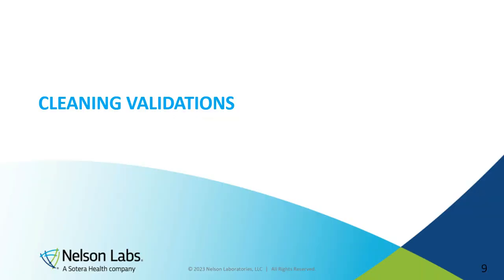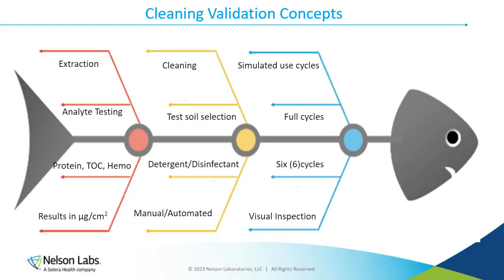I'm going to go over cleaning validations for this part of the webinar and walk you through some of the studies that you have to do within the cleaning validation. Here's a fishbone concept of how we start with cleaning validations, and I'll be talking over simulated use cycles. What are those cycles? Why are they required?